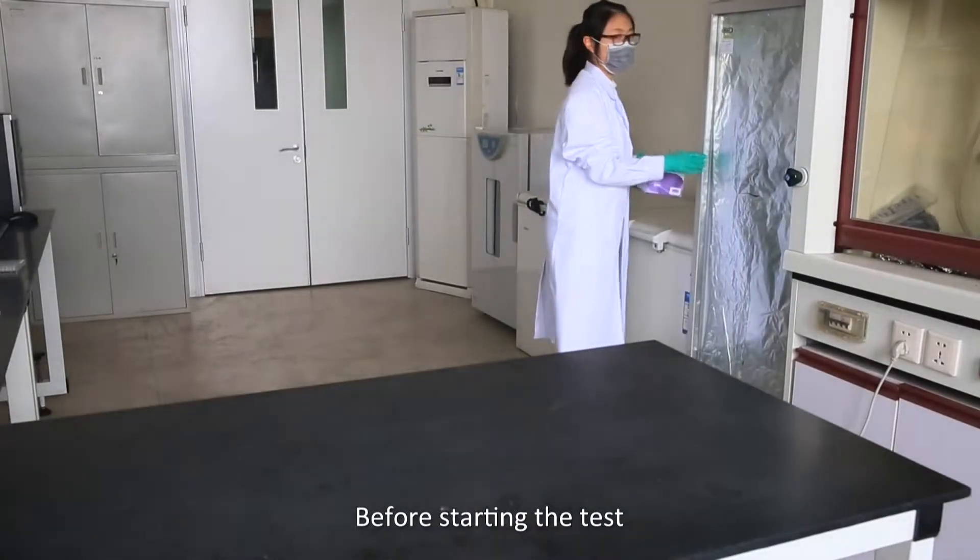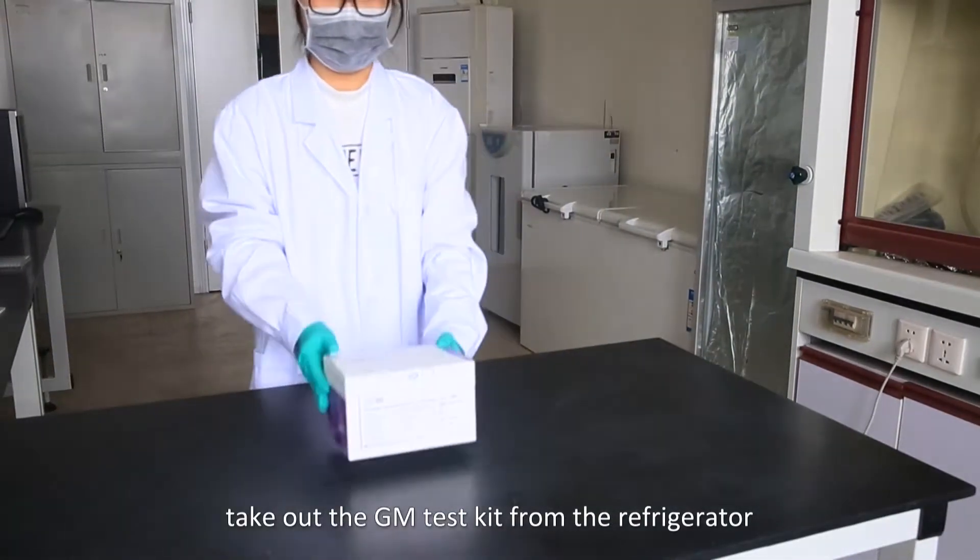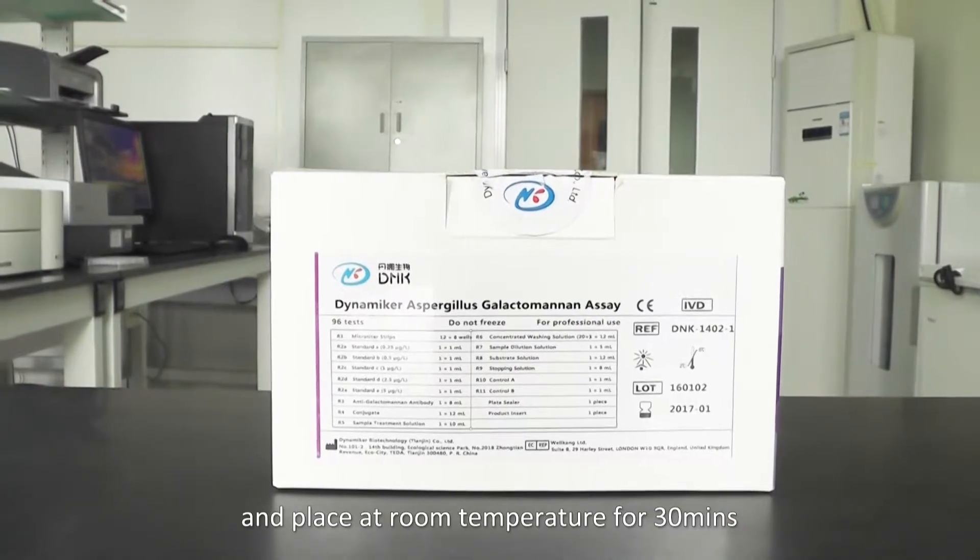Before starting the test, take out the GM test kit from the refrigerator and place at room temperature for 30 minutes.